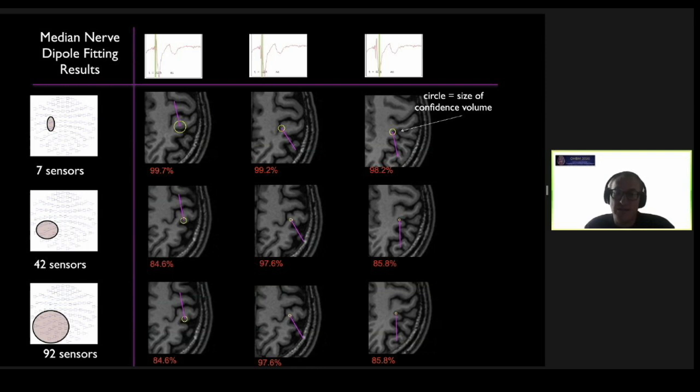If you estimate the source location based on the peak amplitude with the strongest signal to noise ratio, you again get more confidence in where the source is located. So using more sensors is a good idea to increase your ability to locate the source with high confidence, and SNR is a second variable that matters.